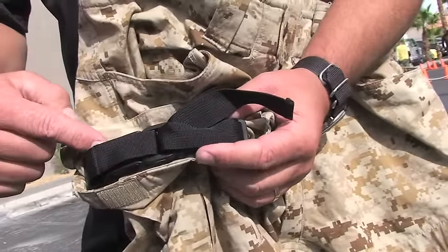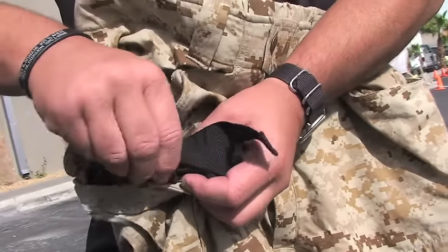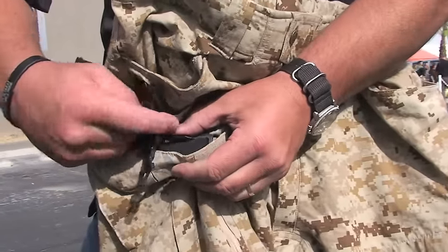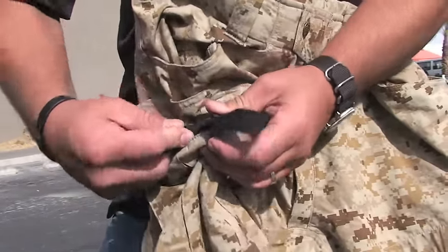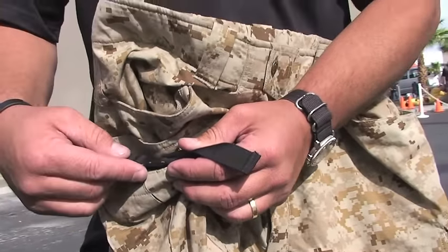You have a windless mechanism and a one-inch nylon band that you simply turn over. You pull it tight against your leg, take the free end, and simply twist it and lock it in. Twist until the blood flow stops, lock it in, and then get out of the fight or finish the fight — whatever you need to do. You're able to continue the fight without worrying about bleeding to death.